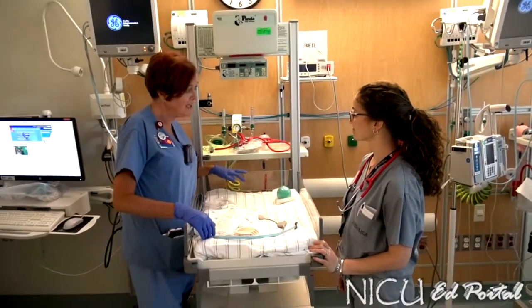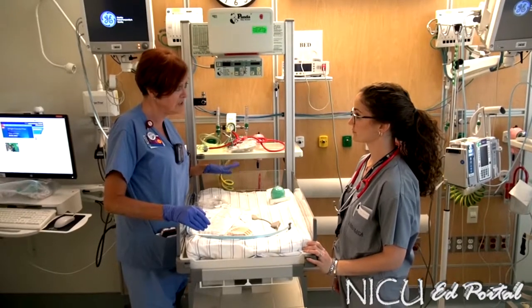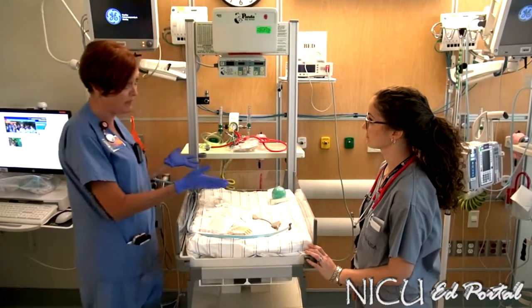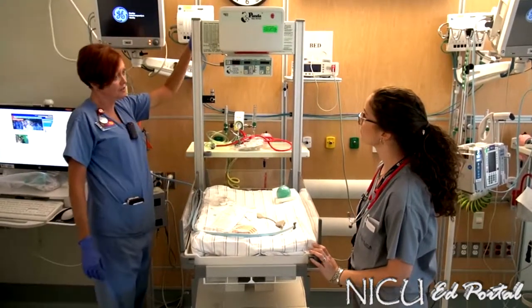Today we're going to set up the warmer as if we were going to have a delivery happen. The most important thing when you get down into the room is to make sure that the warmer is turned on, because the baby does need radiant heat from the minute they come out. Your on-off power switch on this particular type of warmer is over in the corner here.